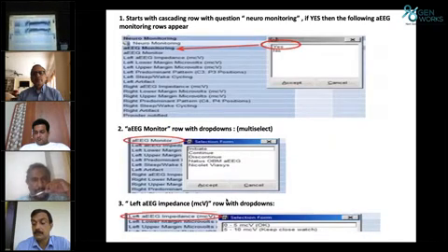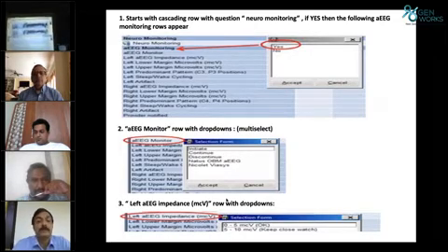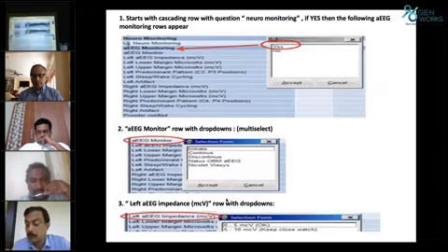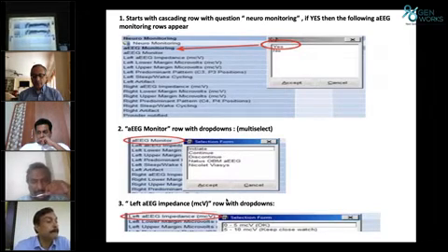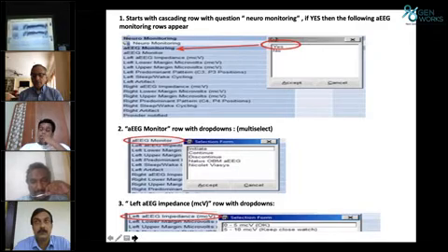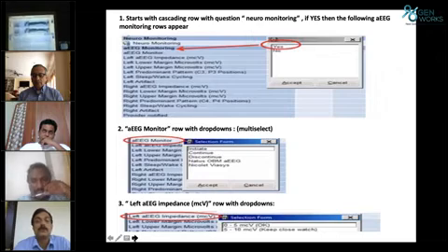Okay, if we are using some electronic device for notes, we have to select the machine, whether we are using the EEG monitoring. So we have to select yes. Then which monitor we are using. If we have a drop down menu of different machines, suppose we can see here the Natus or Nicolet, we have to choose the machine we are using, and then note the impedance of the left leads and right leads. Whatever impedance comes, that should be noted in the electronic monitoring system. Next.